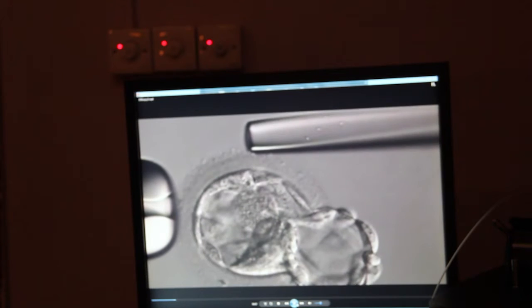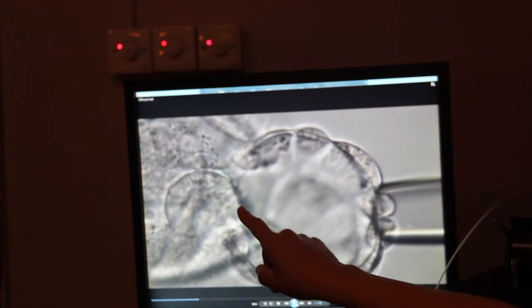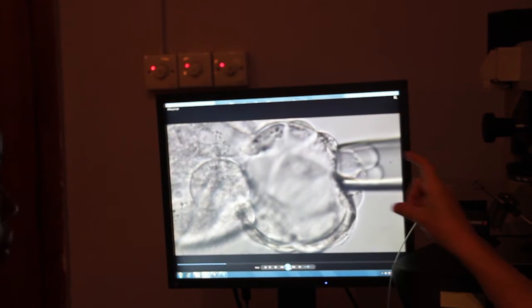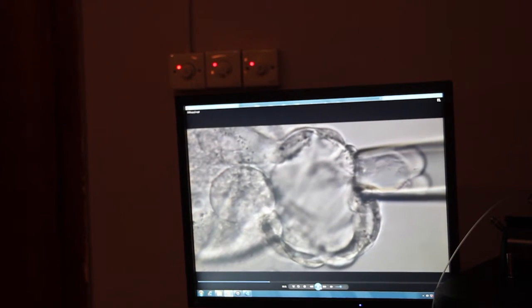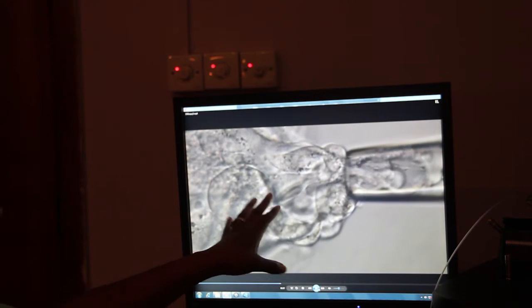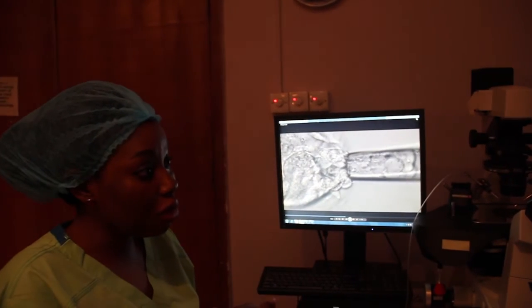So this is an example of a day 5 biopsy. So here in this case we have the trophoblast cells and also the inner cell mass that are inside the embryo. So we need to aspirate the trophoblast cells that will form the placenta. So in this case we're not going to damage the cells from the inner cell mass that will become the baby. Okay? So in actual fact, what you're telling us is that this is a day 5 embryo, and then we have a part that is destined to become the baby itself and the part that is destined to become the placenta. Yes. So we are not in any way altering the baby itself if we do take a part of it to send to the genetic lab for any form of analysis.